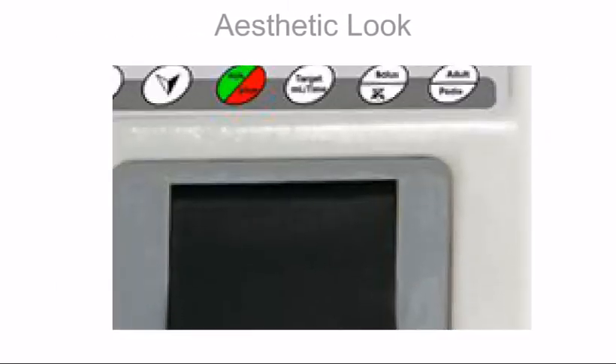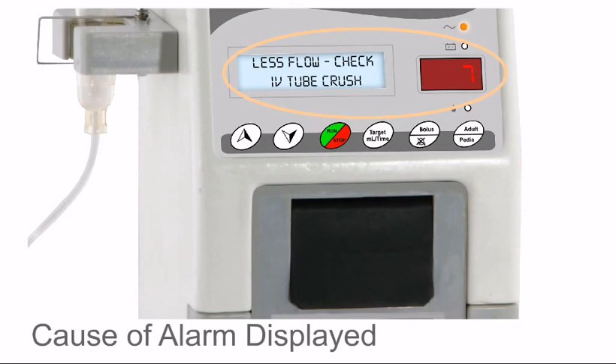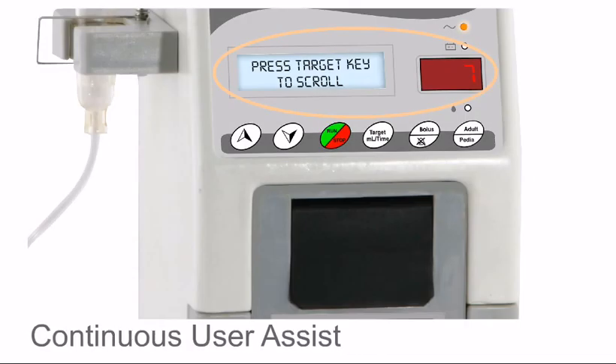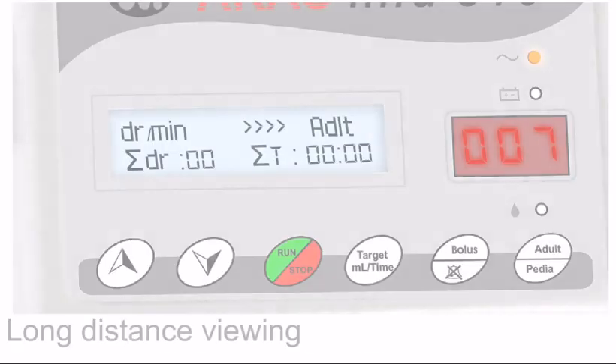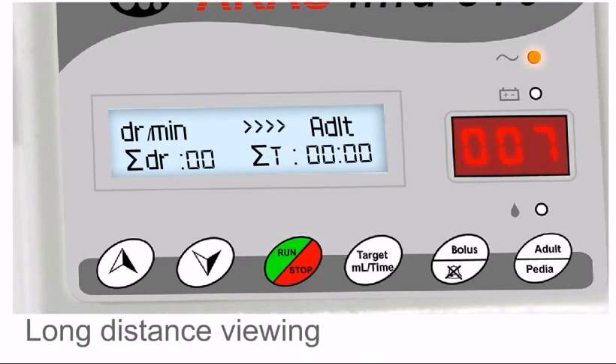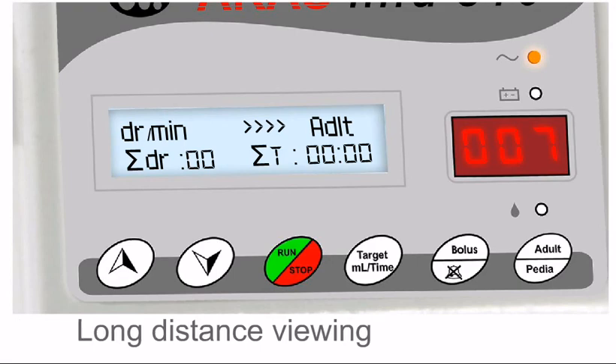Arcas Info 510 has a unique combination of LCD and LED interface for displaying more information. Causes of alarms are indicated with a continuous user-assist menu to guide the operator. The LED interface allows long-distance viewing from more than 15 feet, even in dimly-lit ICUs.